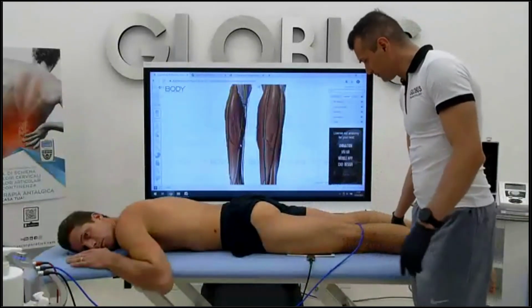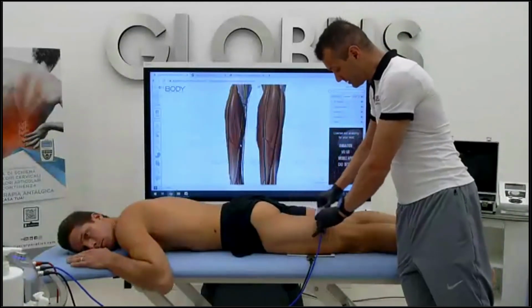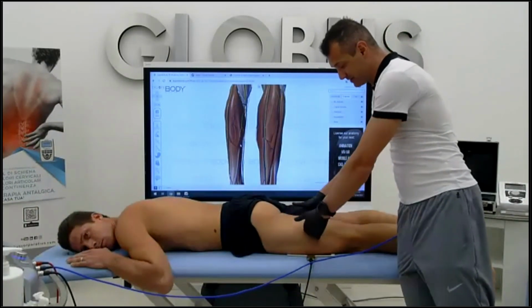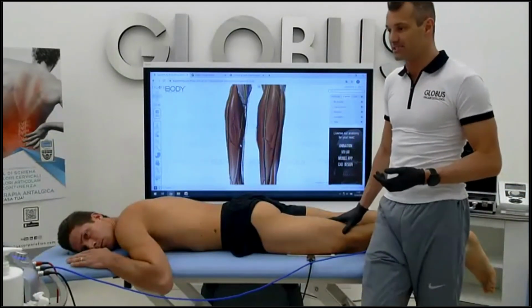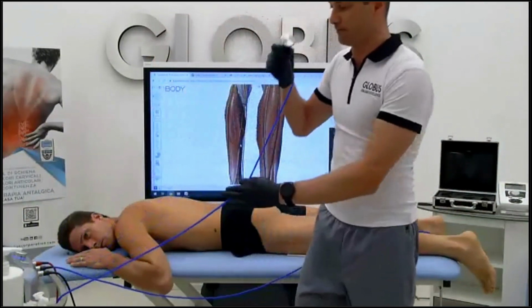But for sure I could do a more aggressive treatment in this area or in the lower part, because I want to solve the stiffness and relax this area. But in the early stages, I will start with the capacitive and maybe some resistive traditional mode, like this one.